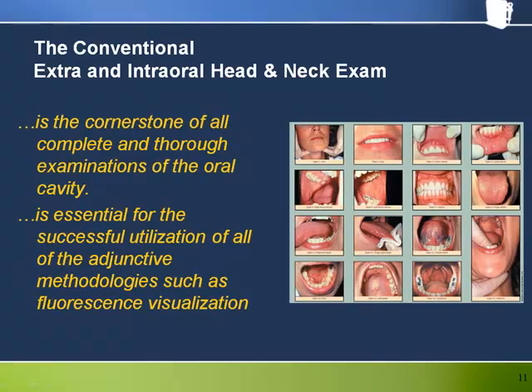The strength of the fluorescence visualization exam is the additional and different information it can provide to the clinician. It's not better than white light exam and palpation, just different. It is certainly not a replacement for this exam, nor is it a replacement for sound clinical judgment.